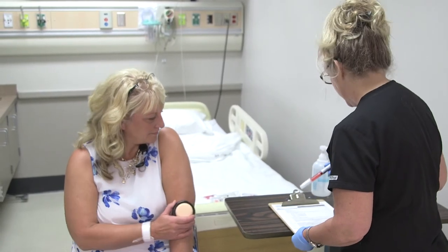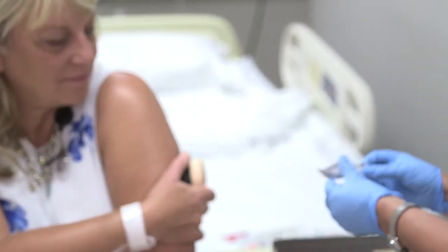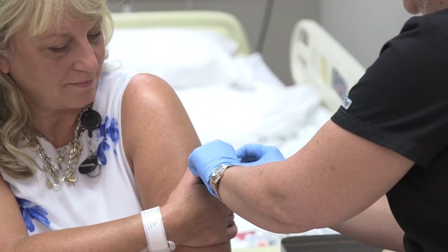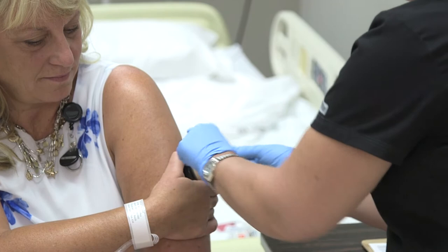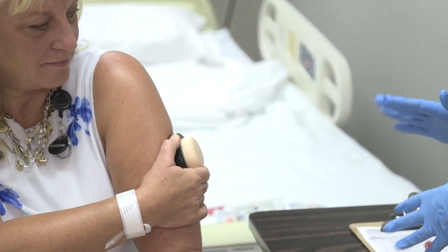There are a few differences between the pen and a regular syringe. It feels a bit different when injecting, and you also have to keep the skin pinched while injecting. We'll let the site dry now.